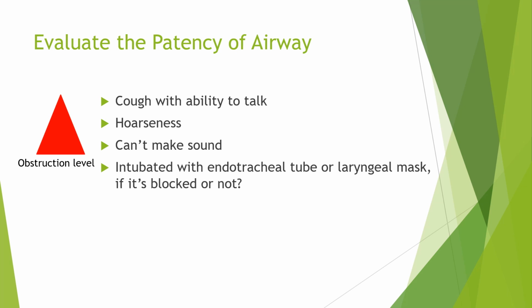And there's one question. If you see an intubated patient with an endotracheal tube or laryngeal mask, but the respiration or ventilation is still having problems, how do you know if it's blocked or not? Okay, we will talk about it later.